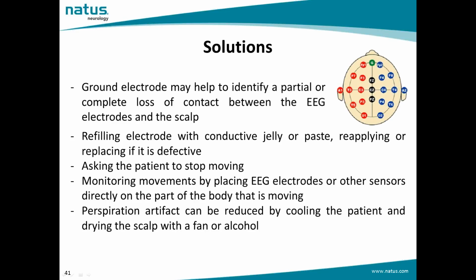Regarding the electrodermal activity, the perspiration artifact can be reduced by cooling the patient and drying the scalp with fan or alcohol.